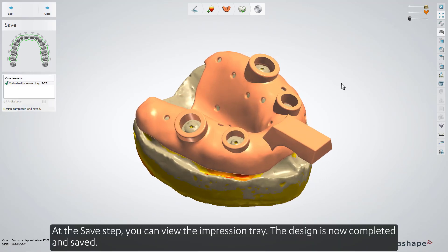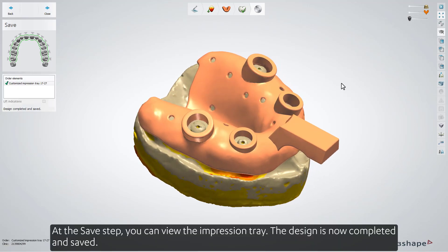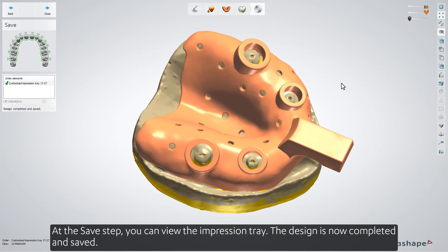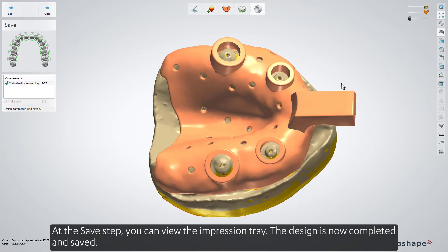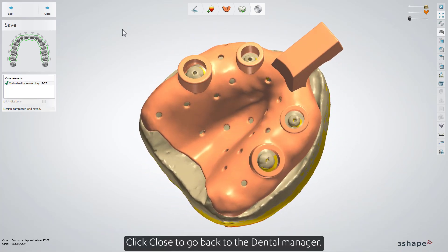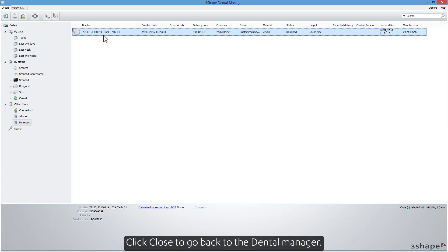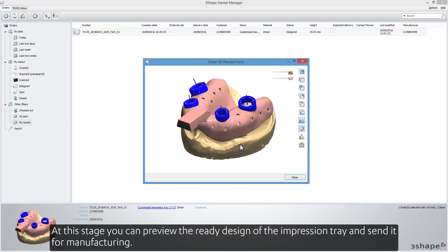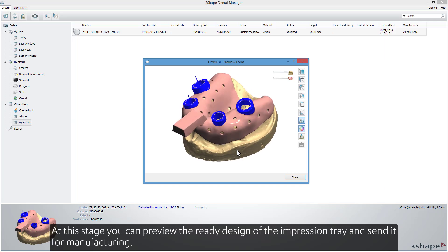At the Save step, you can view the impression tray. The design is now completed and saved. Click Close to go back to the Dental Manager. At this stage, you can preview the ready designs of the impression tray and send it for manufacturing.